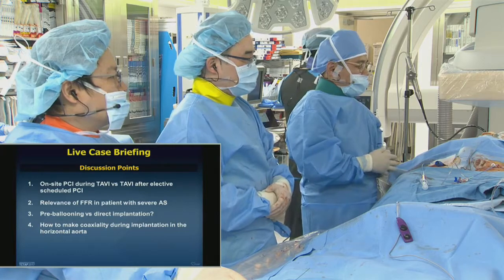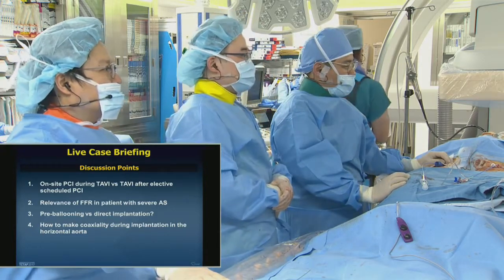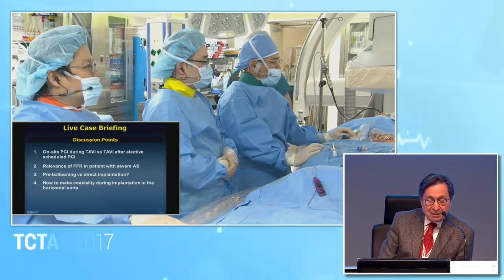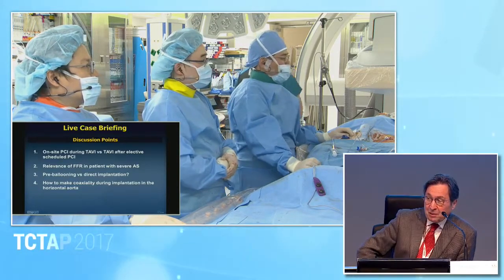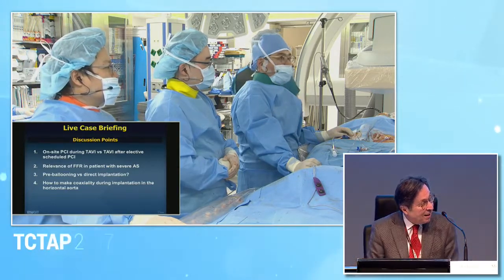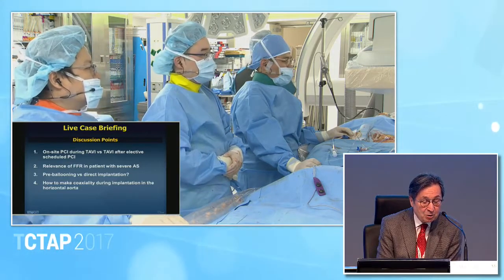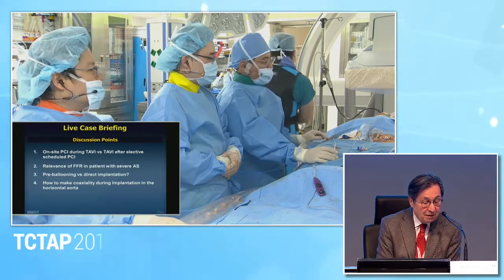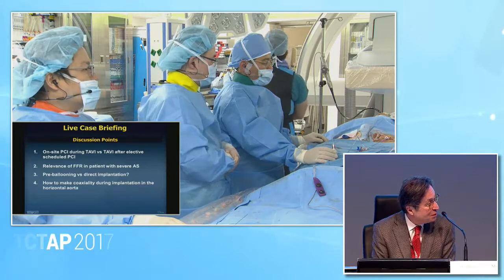Well, that's great. Thank you very much for the elegant presentation and already making our life easy by pointing out the discussion points. Indeed, perhaps we can even add another discussion point: do we need to do the revascularization before proceeding with TAVR? So let me ask the panelists to comment on the issue of coronary disease, and if they think that PCI should be done, should it be done at the same stage or should it be staged?